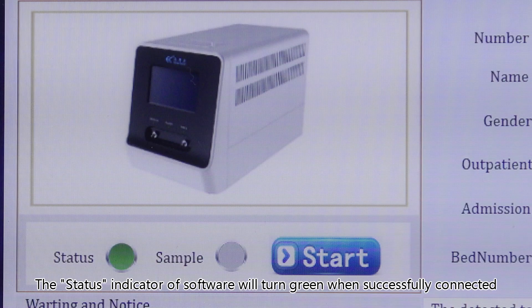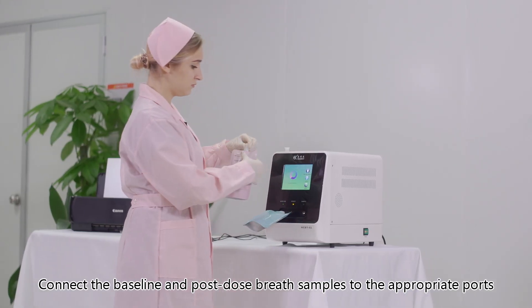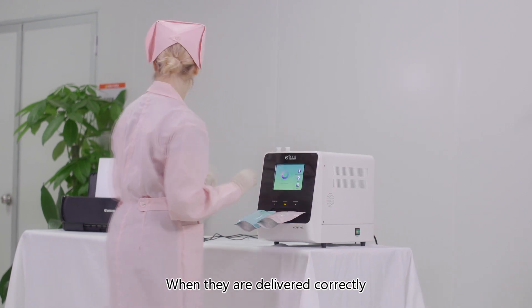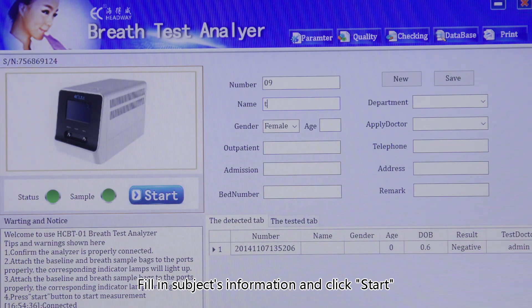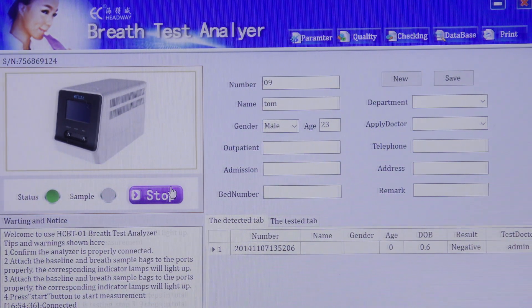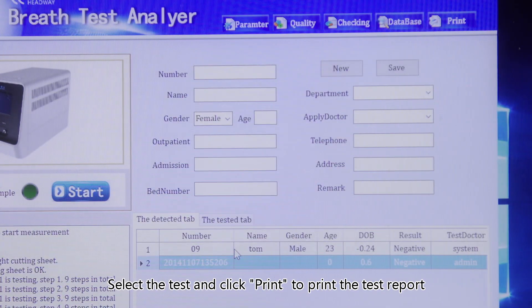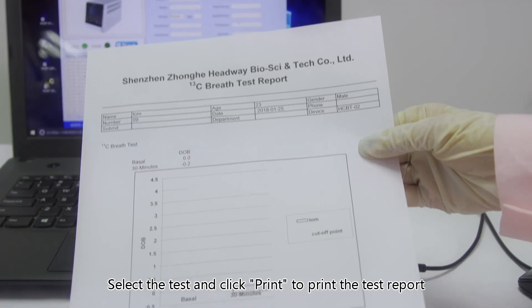The status indicator of the software will turn green when successfully connected. Connect the baseline and post-dose breath samples to the appropriate ports. When delivered correctly, the sample indicator on the operation software interface will be illuminated. Fill in the subject's information and click start. Test results will be saved automatically when the test completes. Select the test and click print to print the test report.